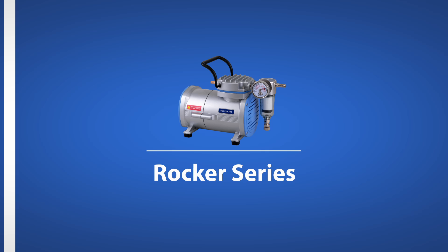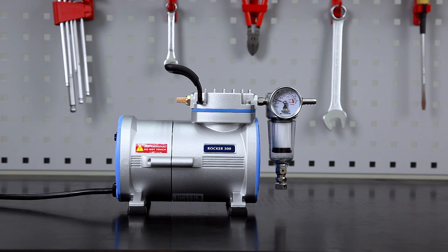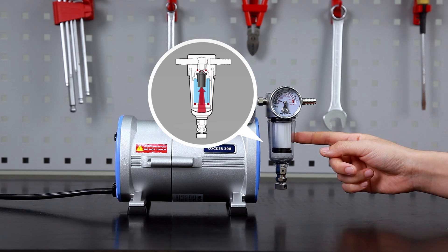Hi, this is Rocker Troubleshooter. We give you instant solutions when you have troubles with Rocker's product. If you notice that the gauge shows high vacuum with or without the pump being started, it's very possible that the protective device is blocking the inlet.